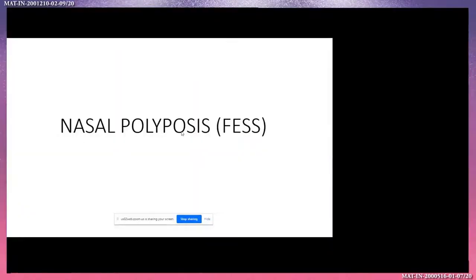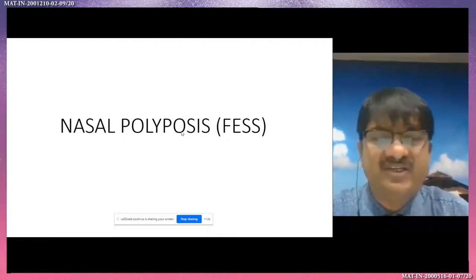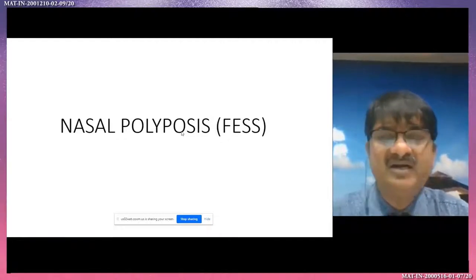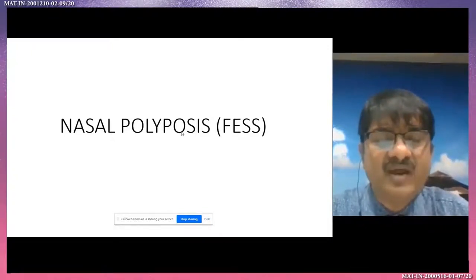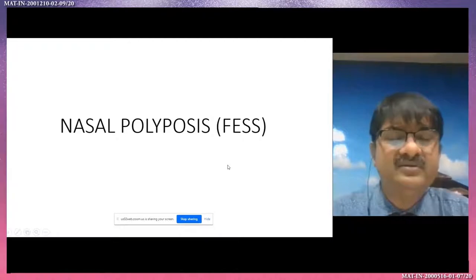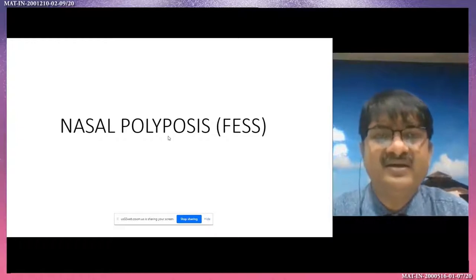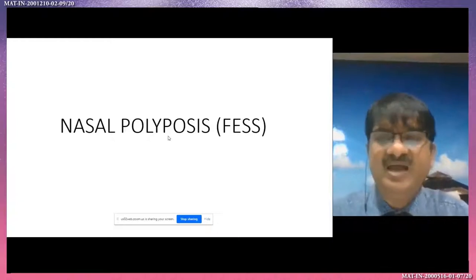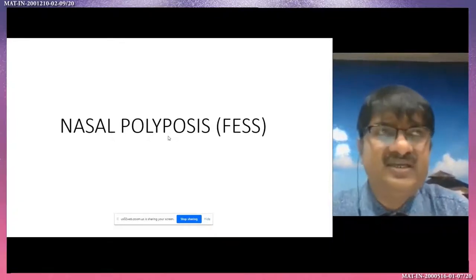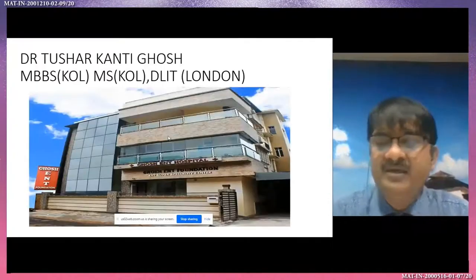Good afternoon everybody. Today I will show nasal polyposis due to allergy, bilateral nasal block. This is a 25-year-old adult presenting with nasal obstruction. I will show the simplified nasal polyposis surgery, or functional endoscopic sinus surgery — how a beginner will start the surgery in a very simplified way with less complication.